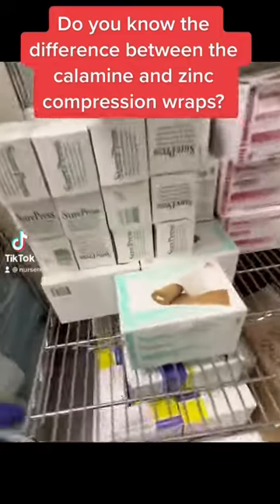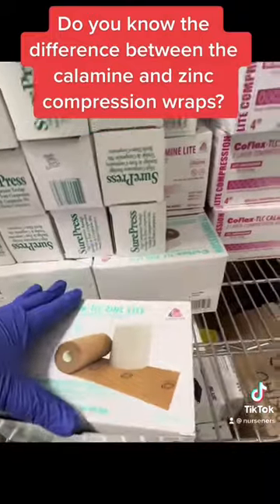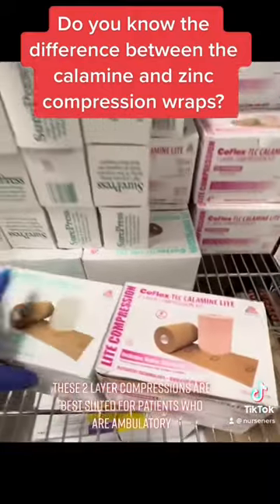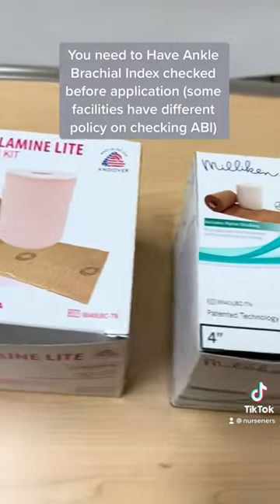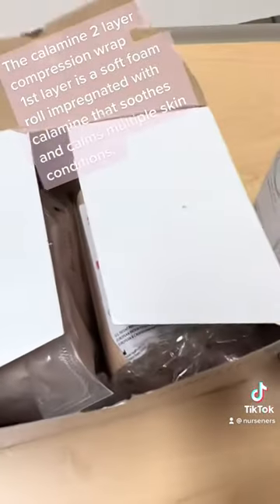Do you know the difference between the Calamine and Zinc compression wraps? These two-layer compressions are best suited for patients who are ambulatory. You need to have ankle brachial index checked before application. Some facilities have different policies on checking ABI. This is the Calamine two-layer compression wrap.